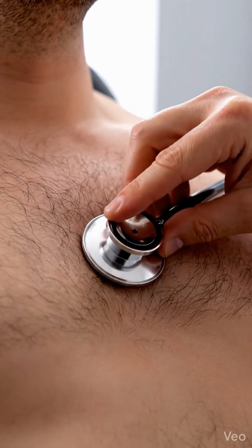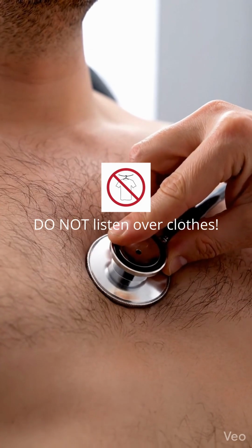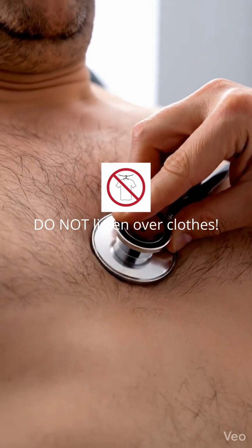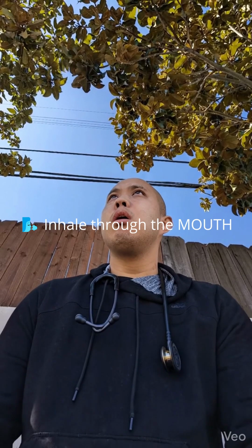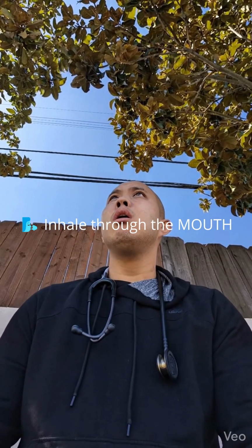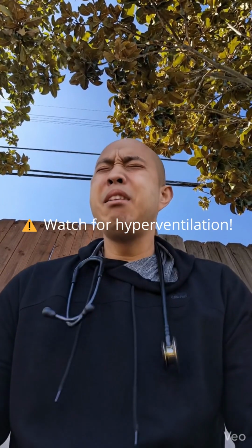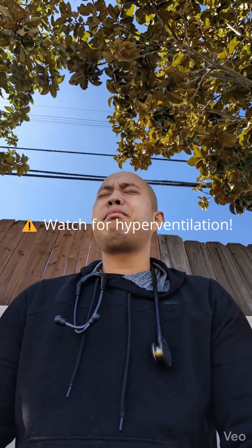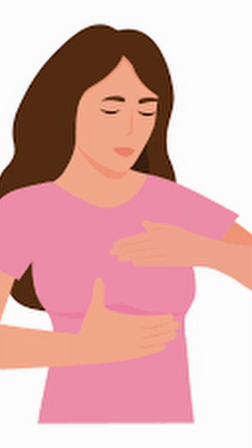First, the gear. Always use the flat diaphragm of your stethoscope and press it firmly against the skin. Never listen through clothes, because that creates friction that sounds exactly like abnormal crackles. Instruct your patient to breathe deeply through their mouth. Breathing through the nose creates upper airway noise that corrupts your assessment. Make sure to keep an eye on the patient so they don't get dizzy or hyperventilate during the auscultation. And do not listen over breast tissue.